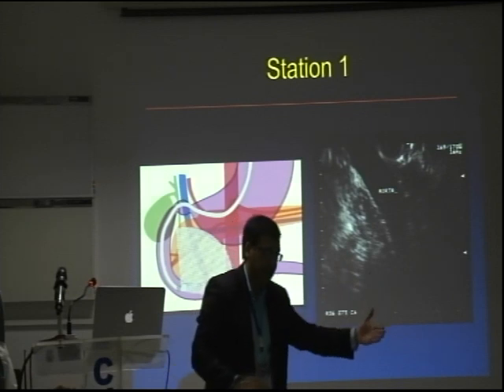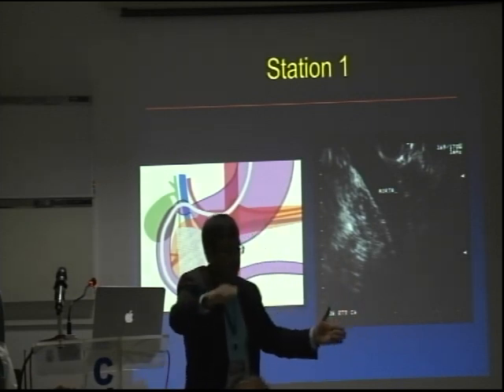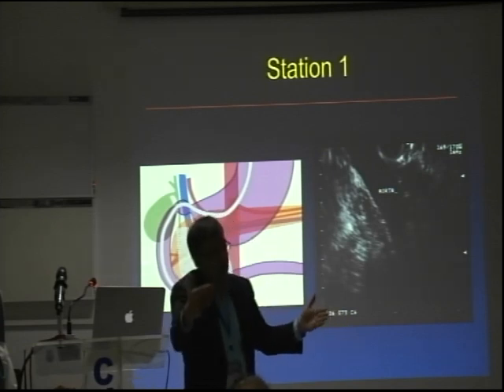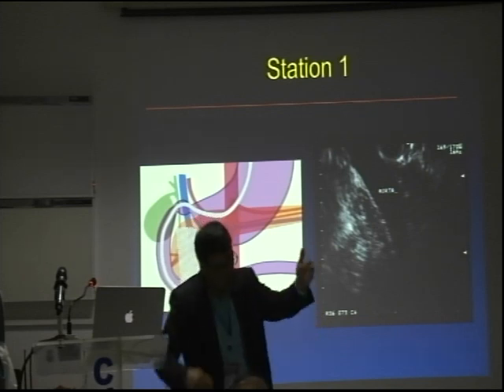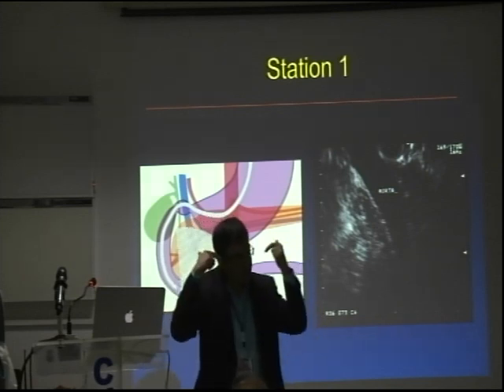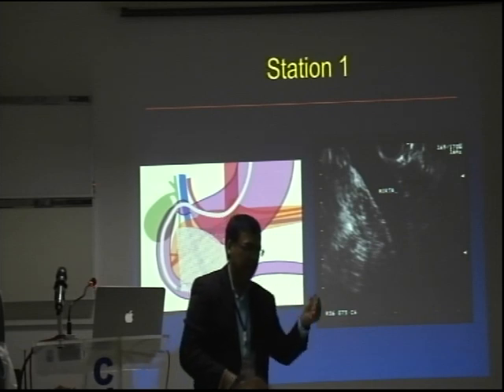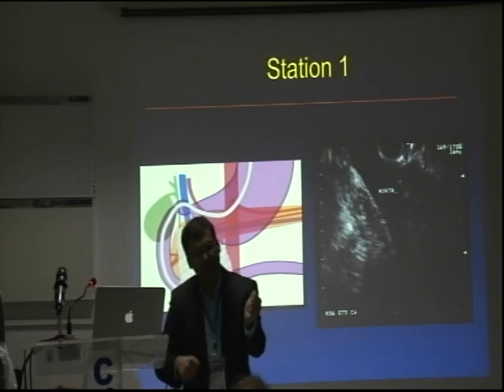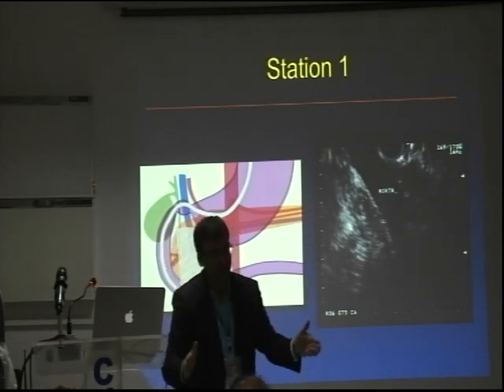and then the right kidney. I'm talking about the screen, the EUS image screen. On the right is going to be the bile duct and then the pancreatic duct. So that's the order. We will keep demonstrating it during the live as well when we do that. So from the aorta, you go to the left: IVC, right kidney. From the aorta, you go to the right: bile duct, pancreatic duct. It is always going to be the same sequence.